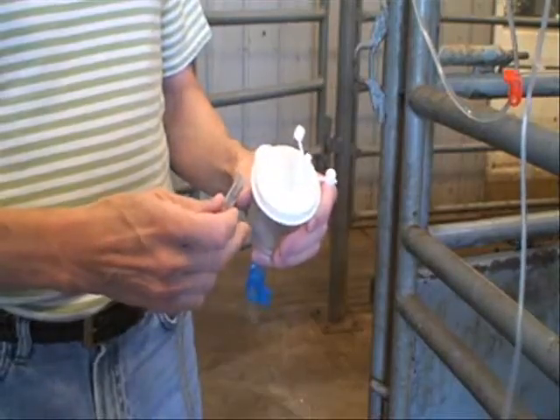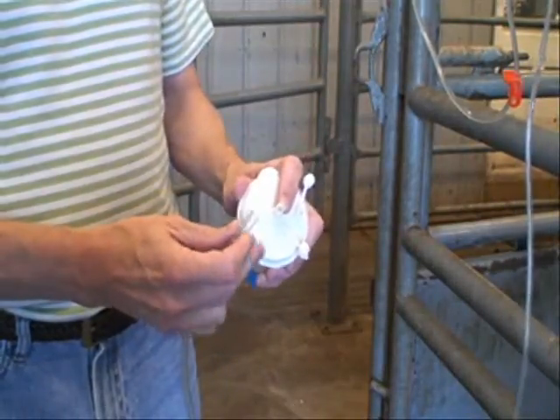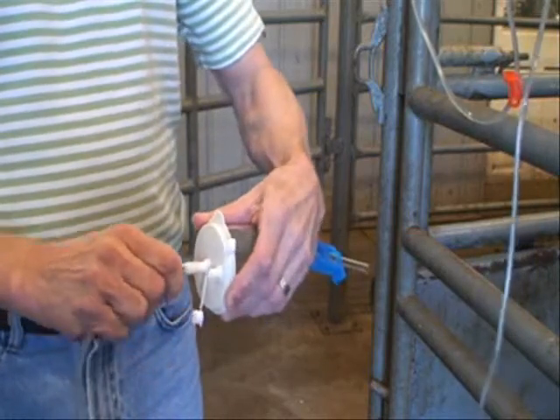Now we're stall side with the filter. Take the Y tubing set, put your finger as a little back stop, push that over, then push and twist.